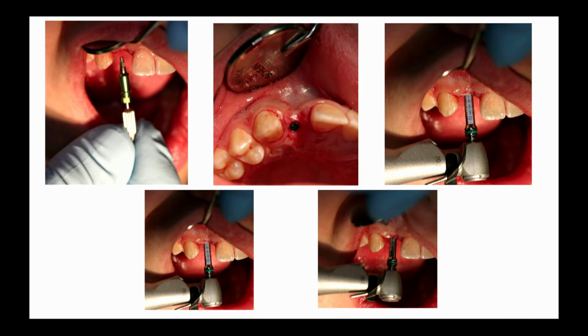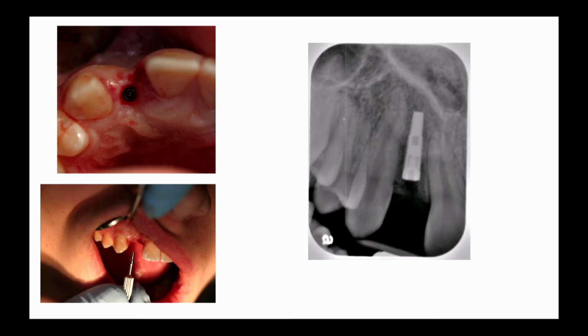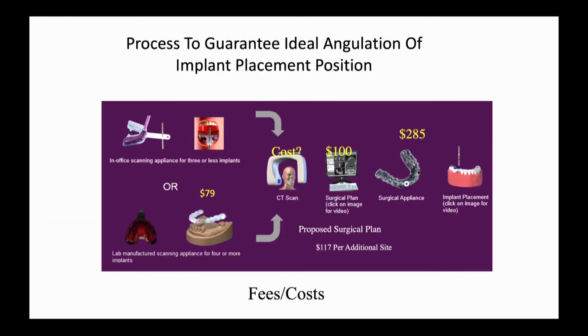So you can see here we're just deciding how deep to drive the implant in, and when we're satisfied with the implant depth, then your next step is either temporize in some fashion or just move forward. So there's your final x-ray. And your x-ray shows you got pretty good ideal placement. Place subcrestal again, because in my cases, if I can go subcrestal, especially in the aesthetic zone, it gives me just a deeper emergence profile, ability to build the emergence profile the way I want to build it. All right, so that's the concept of guided surgery.